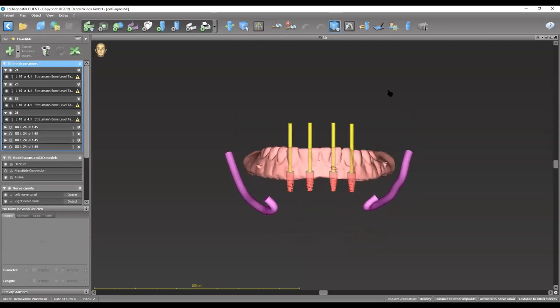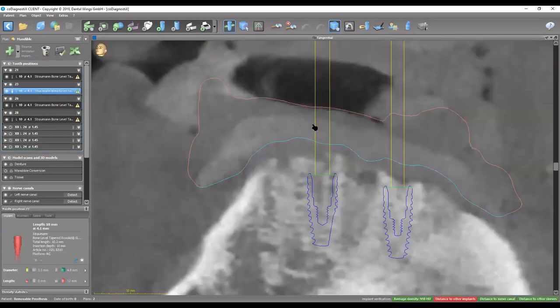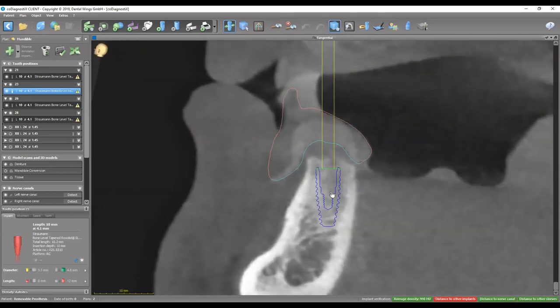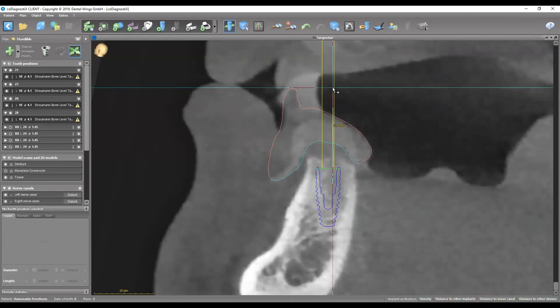Moving on to the implant sites, starting with the anterior implants — let's check number 23 first. This is a 4.1 by 10 millimeter Straumann implant. First thing is to make sure the distance from the implant platform all the way to the occlusal table or incisal edge is more than 10, around 10 to 12 millimeters. Right now it looks like we've got around 13.5 millimeters, which is more than enough. As long as the distance is more than 10, it should be really good.